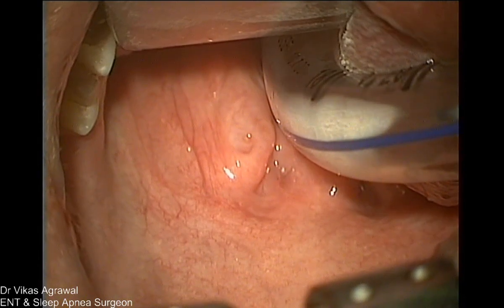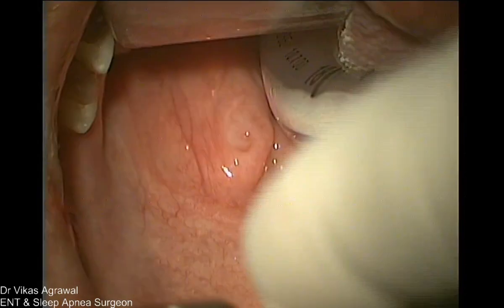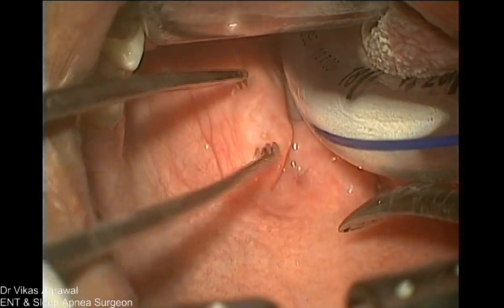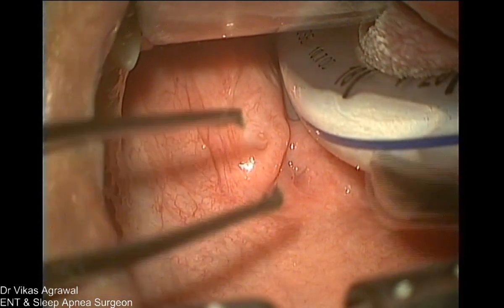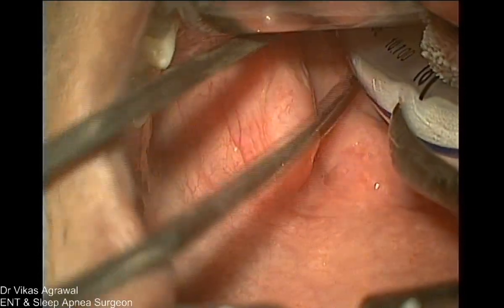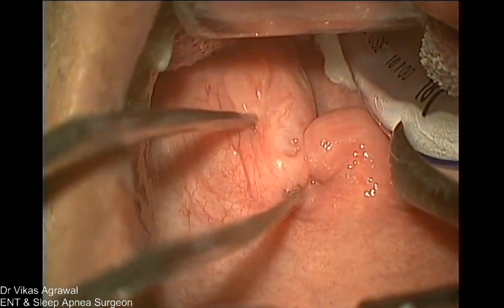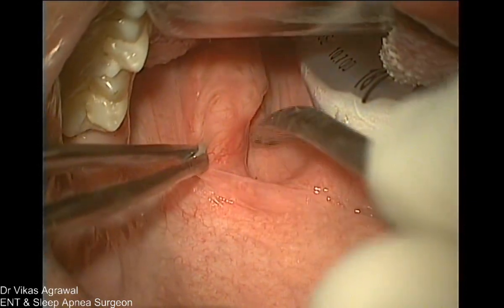So now this is the microscopic picture going on. You can see that that's the soft palate. Is it in focus? Yeah. So you can see that this is the soft palate. This is the endotracheal tube. There is the throat pack there. This is the throat pack. This is the uvula. You can see that it's a big and redundant uvula. This is the tonsil, left tonsil. This is the anterior pillar, and that's the posterior pillar.